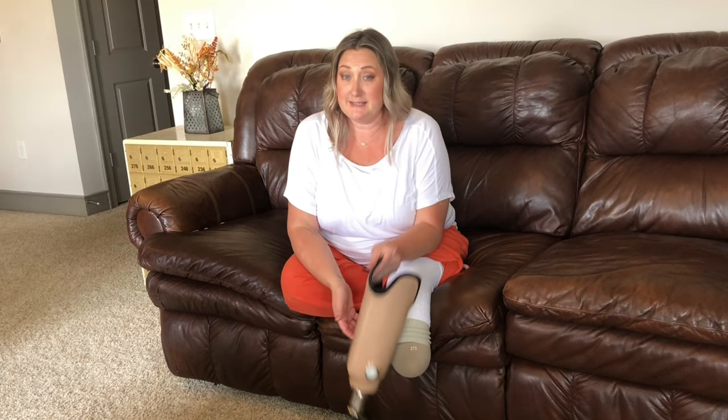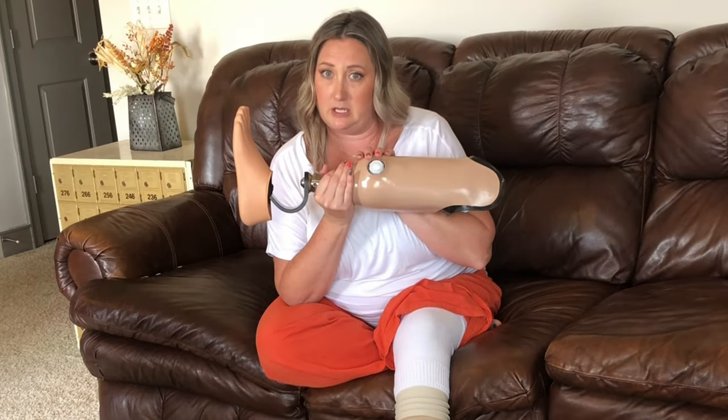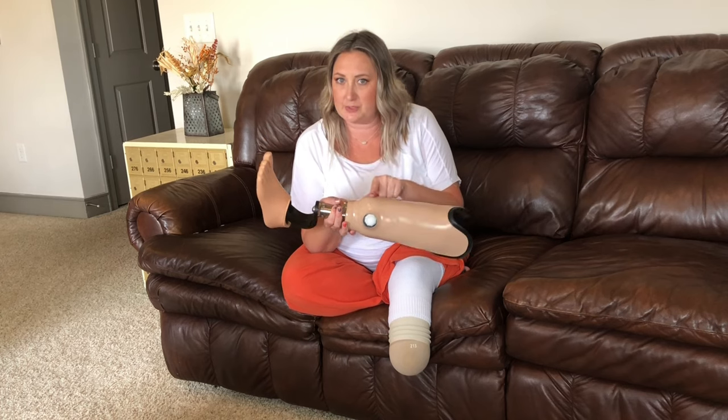The other reason I cannot have a direct fit socket is because my limb is so sensitive. My residual limb is like this dainty little limb that you can't touch it, can't look at it wrong, can't talk about it wrong — otherwise it hurts. So I have to make sure I have the correct relief areas, which might be a challenge with the direct fit socket. With my particular insurance, I had to get one socket — that's it. If they make it wrong or it doesn't fit, there might be some big challenges. So I decided to go with a traditional socket instead.